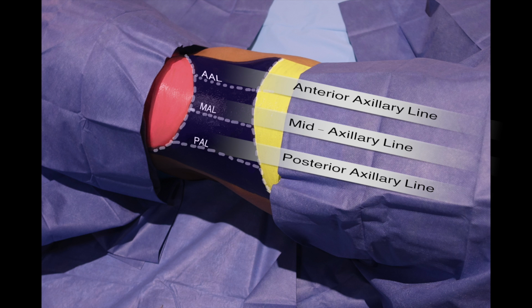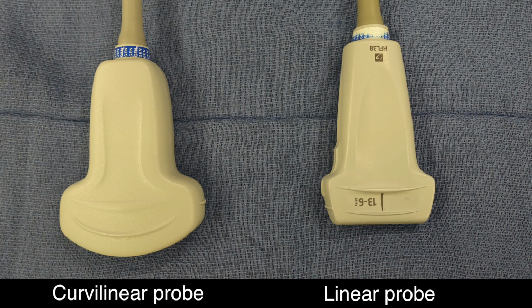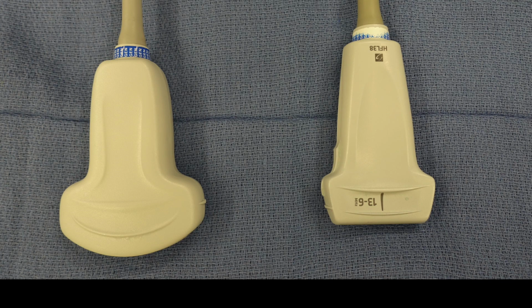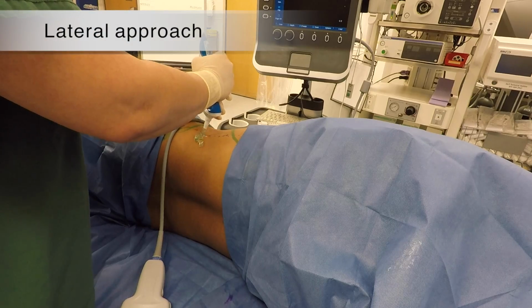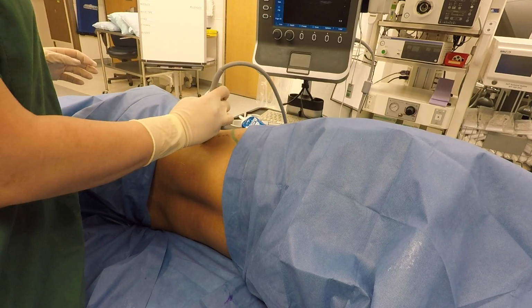First, place the patient in a lateral decubitus position. Next, position your ultrasound on the opposite side of the site for the block. Determine whether a linear or curvilinear probe is most appropriate for your patient. This is determined by the body habitus of the patient, such as a pediatric versus an adult patient. Then perform a timeout confirming a valid consent, allergies, correct patient, and correct side.